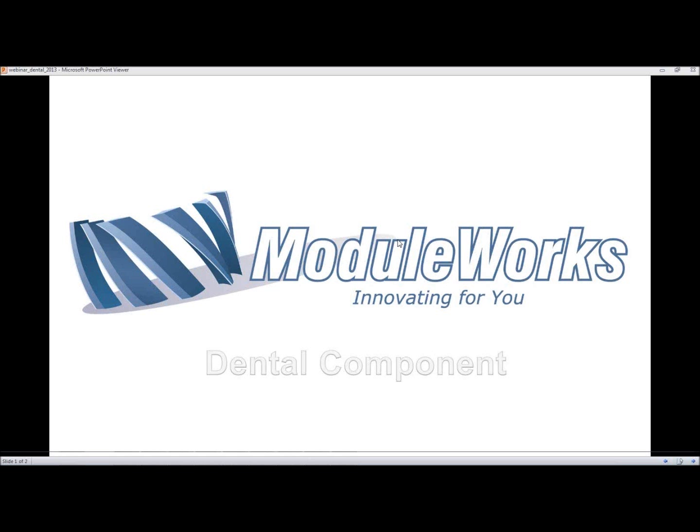So today we are going to demonstrate the features of ModuleWorks Dental Framework, which is a software component that runs behind the scenes of nesting software, which is used for dental manufacturing of crowns, bridges, telescope, inlays, and different types of dental indications.